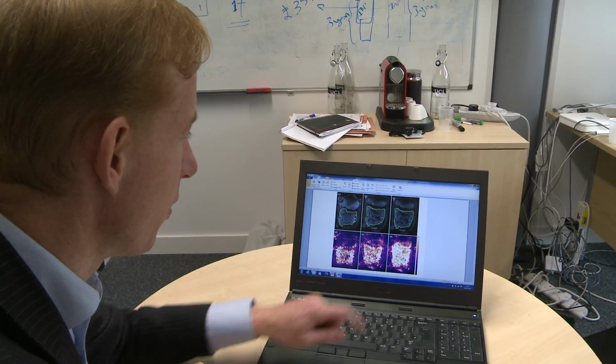and also very expensive. In recent years, developments in MRI have really revolutionised how we examine the gut in clinical practice. With modern MR scanners and sequences, we can now get very good anatomical information about the structure of the gut. We're now moving towards whether we can measure function as well as structure. For example, at UCL, we've developed software which can quantify the peristaltic or motion activity of the gut, which is very important in a whole host of different diseases.